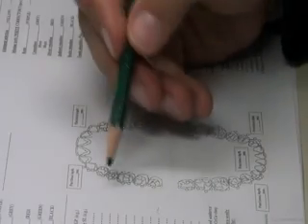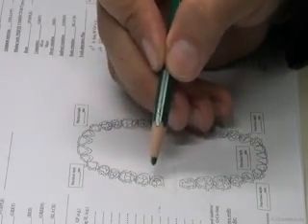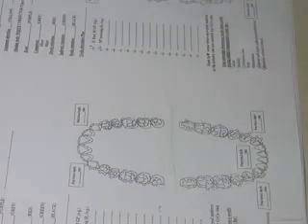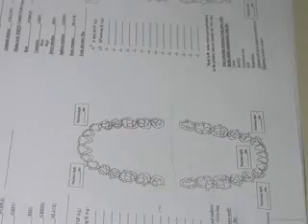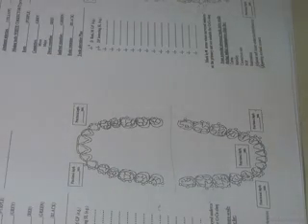Okay? So when I want to fill in, the design here has empty circles. Can you see the empty circles around the teeth? These empty circles around the teeth are to tell you where my suitable undercut is. So after surveying, wherever you find your undercut, put a mark on it. So you're going to fill in the circle, saying that my suitable undercut is here, on this tooth. Okay? So also we fill in the undercut. This is how to fill the form.